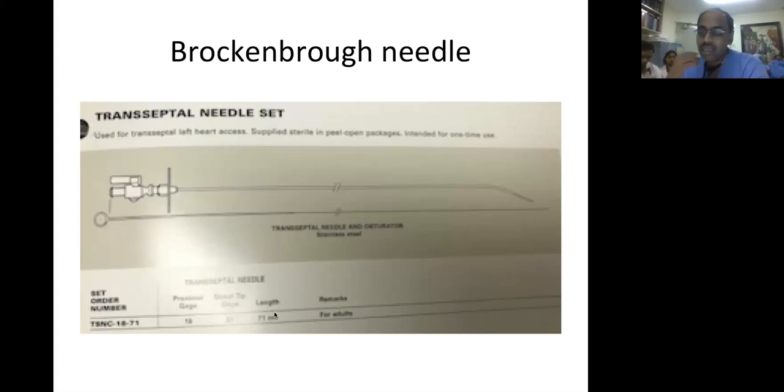A congenital mitral inflow obstruction, where you want to do a balloon atrial septostomy, say you want to create an atrial septal communication, you have to do it. So transseptal puncture is a very important part of various therapeutic procedures. It's also a part of various diagnostic procedures.